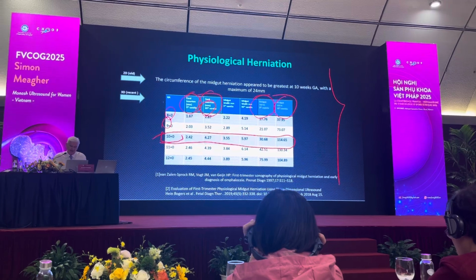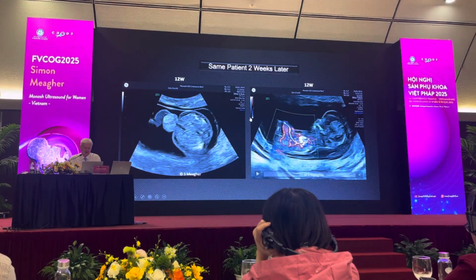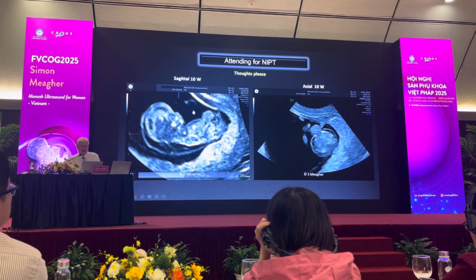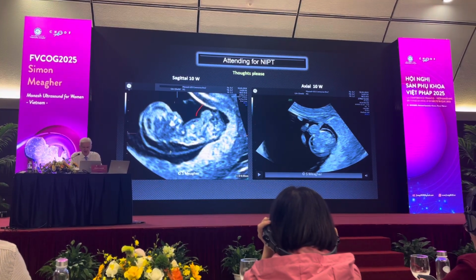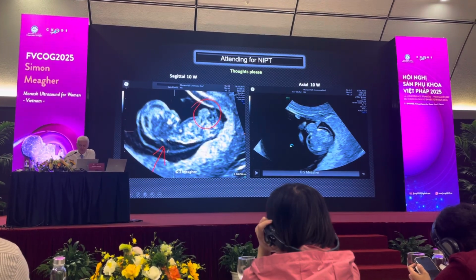Personally, I don't use this. I go on subjective assessment. But for those of you in training, you need to have a cutoff. Because when I did this scan at 10 weeks and 6 days, I knew that this was not physiological. I had another clue.